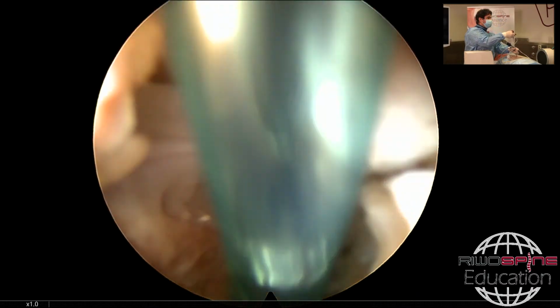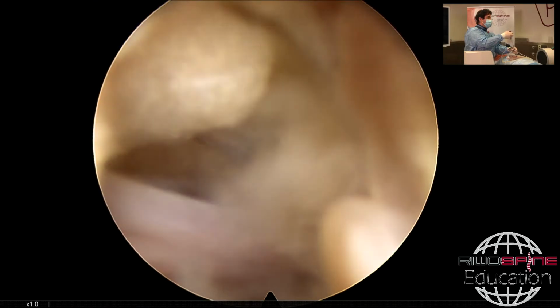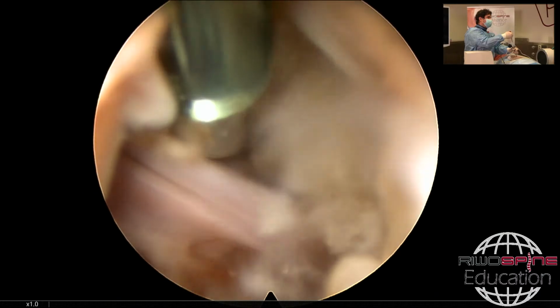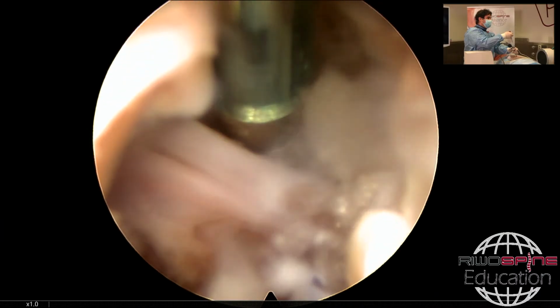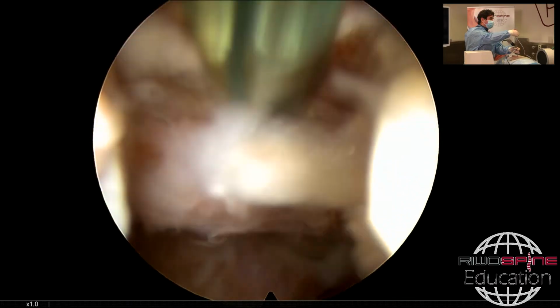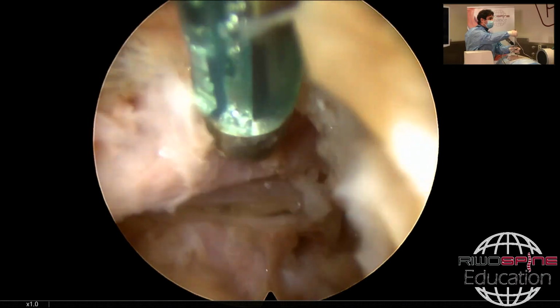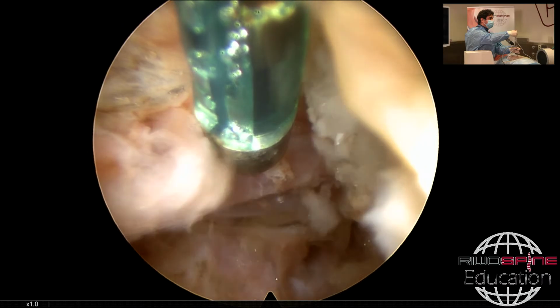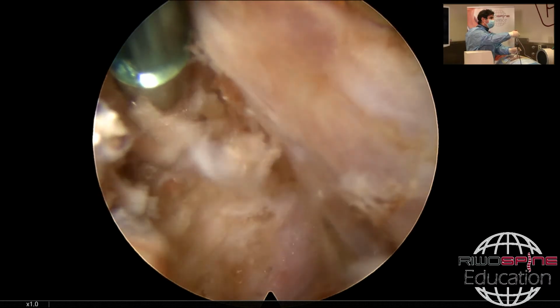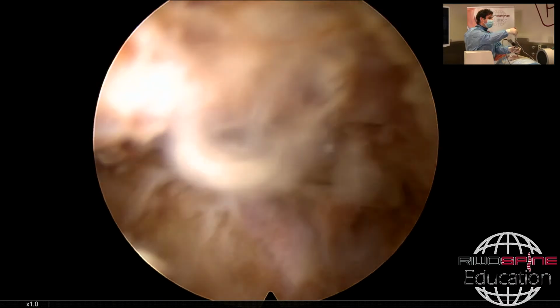This is the nerve root, the shoulder of the nerve root, and the caudal, the thecal dura, and then also this is the axilla of the S1 nerve root. We are at the level L5S1. You see the shoulder of the S1 nerve root, the axilla of the S1 nerve root, and we can check the caudal side easily without any bony resection.